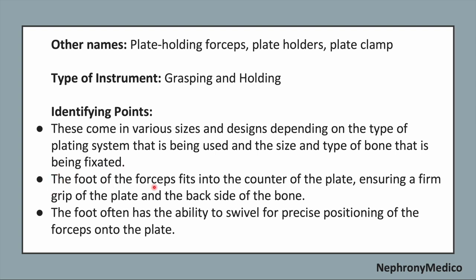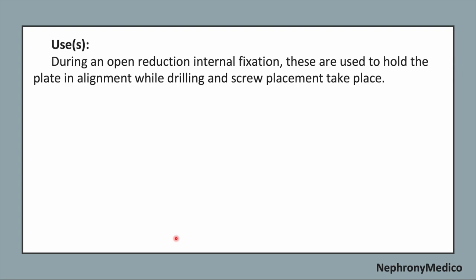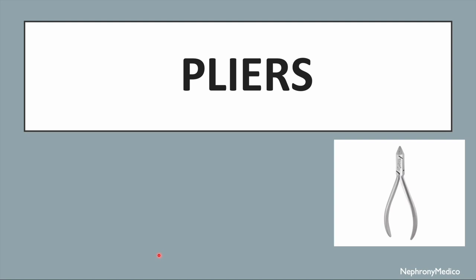The foot of the forceps fits into the contour of the plate, ensuring a firm grip of the plate and the backside of the bone. The foot often has the ability to swivel for precise positioning of the forceps onto the plate. Uses. During an open reduction internal fixation, these are used to hold the plate in alignment while drilling and screw placement take place.